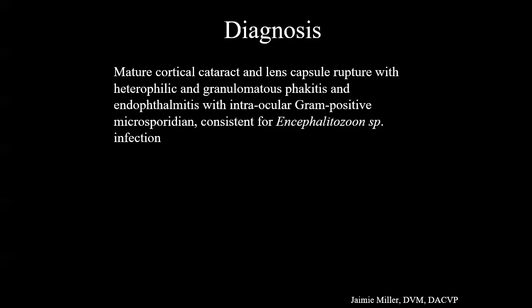Let's see. And then, like I said, that region of retinal atrophy was a little unusual, but possibly it could represent a glaucomatous lesion. There certainly was reason that there could have been glaucoma in this rabbit with all of the changes, the lens and pupil block and all that stuff. They said glaucoma was unknown for this rabbit, so it's just a potential possibility.